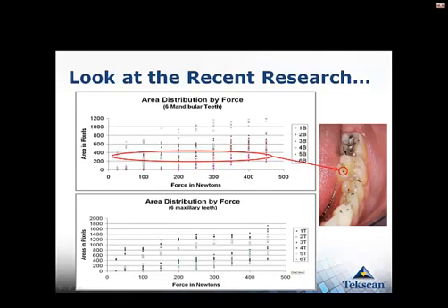Now obviously this isn't from the study, but this would be something you would see in your practice. This particular articulating paper mark, say that that's 300 pixels. Well, that could be 25 newtons, 100 newtons, 250 newtons, 400 newtons. And so what really hit me with this study was that this is why my doctors are so frustrated with occlusion, because it's not easy.